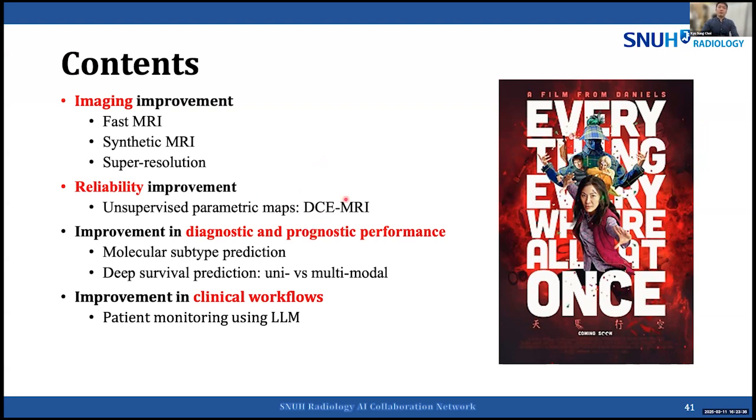So in our hospital, we use an AI engine with MRI reconstruction models for clinical practice to read for real patients. So I think the most generalizable neural network models are two models, which are segmentation and the MR reconstruction models.